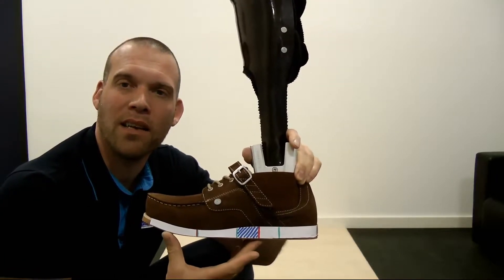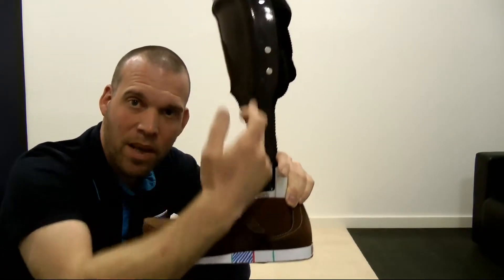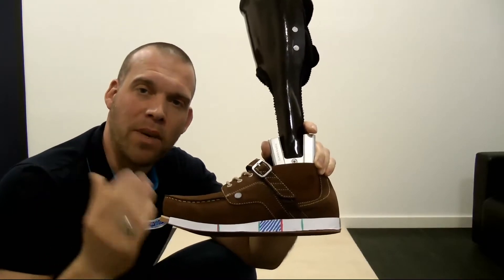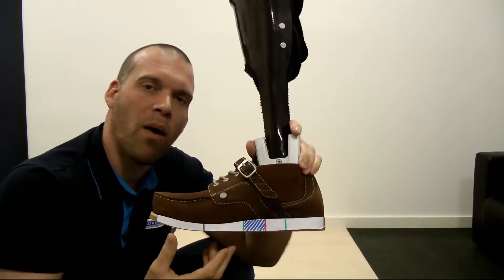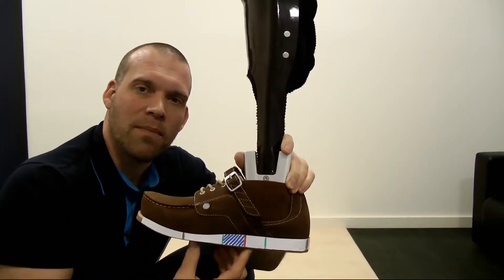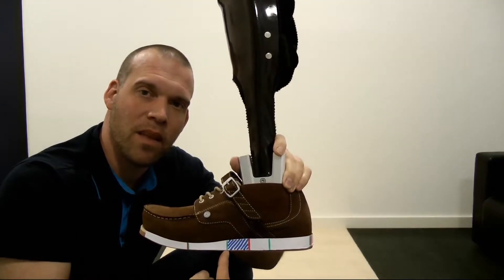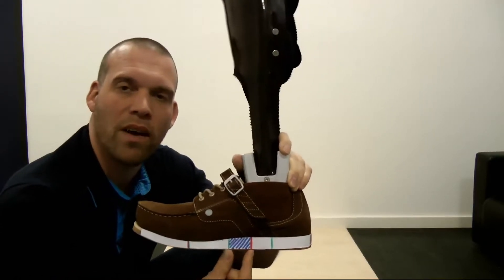To recognize the front half of this area is pretty easy. We divide this area by two, and if the center of gravity line from the mid-AP falls into the front half, that's not bad. However, to create ideal conditions for the dynamics, it makes sense to align the plumb line exactly and as physiologically as possible — dropping it from the center of gravity through the mid-AP so that it falls into the hatched area shown here. This limits the area much more precisely than just saying the front half.